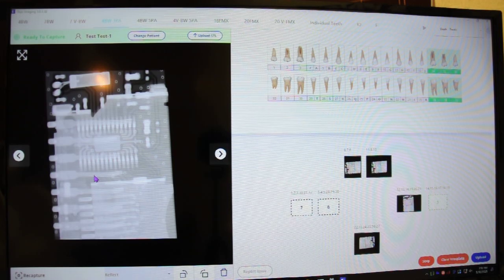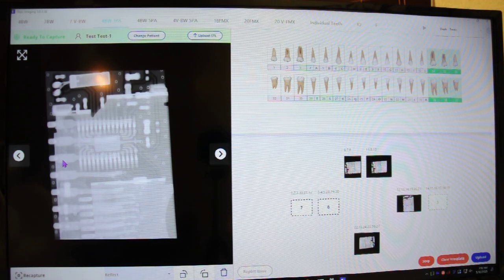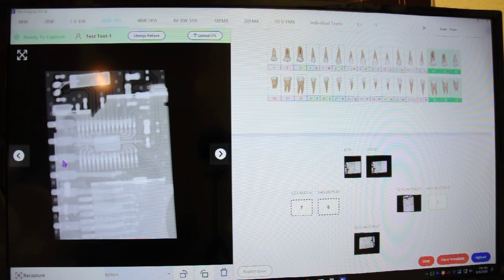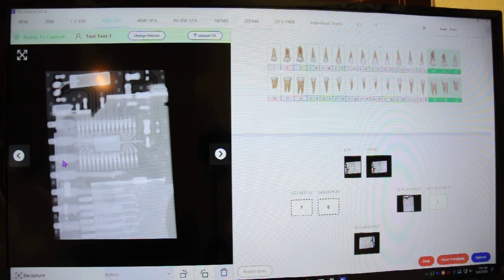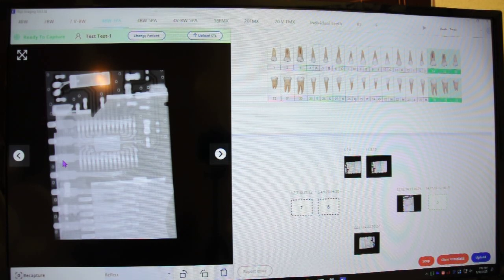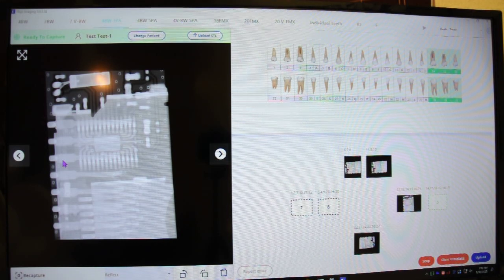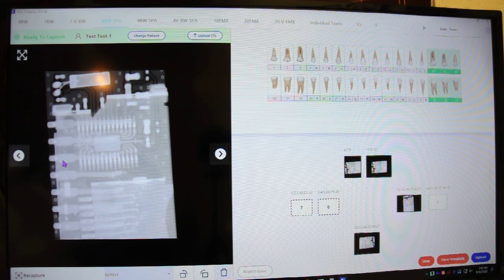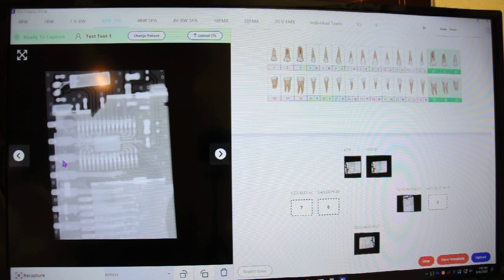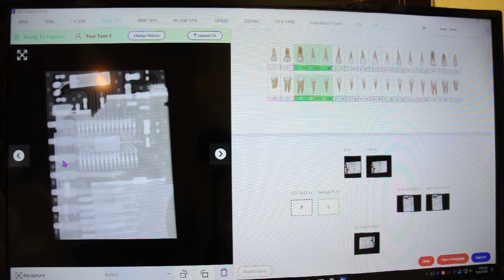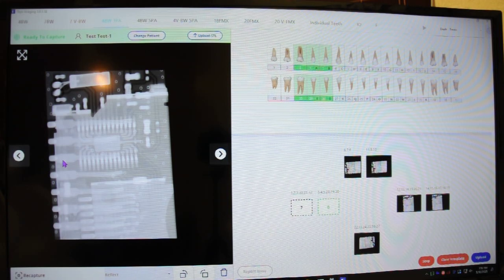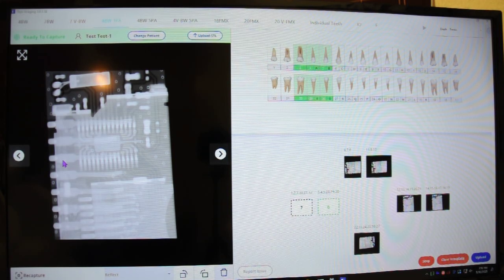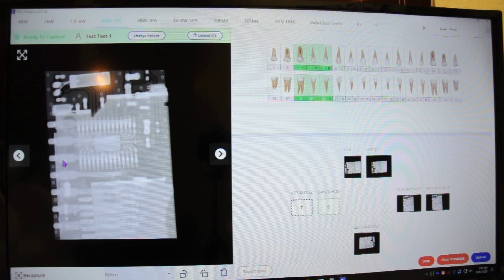Moving on. That's good. Continuing on. Oops. Hit too soon. Yeah. Alright. Two more, Mrs. Smith. Just hang in there. Don't choke on the x-ray sensor.